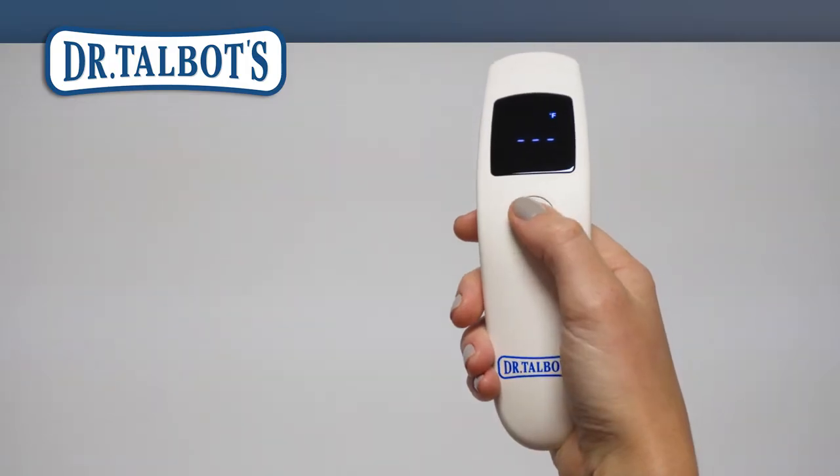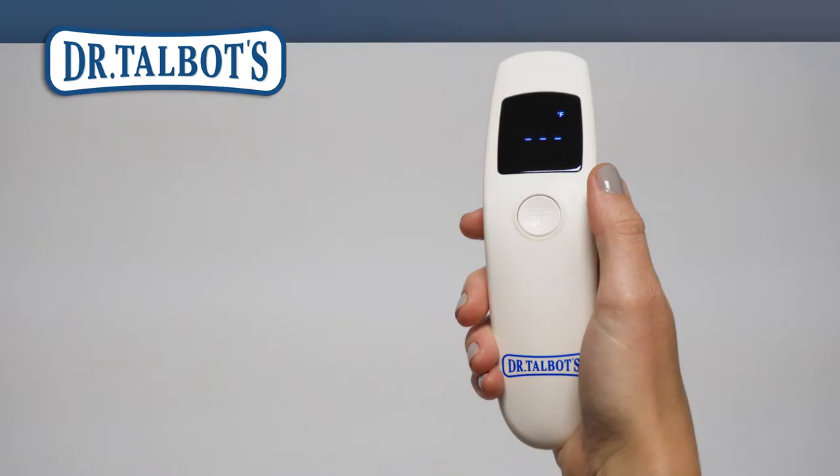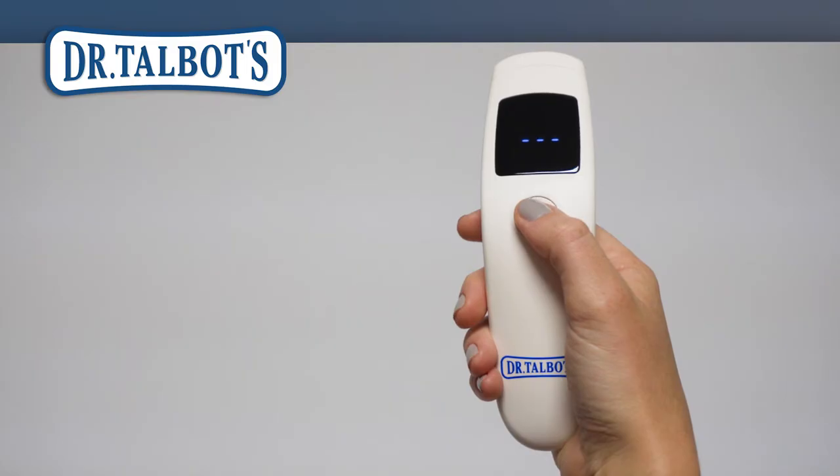Press the button again to change the displayed measurement scale to the measurement of your choosing. The measurement scale will be displayed on the top right side of the display screen. Choose F for your measurements to display in Fahrenheit or C for your measurements to display in Celsius.